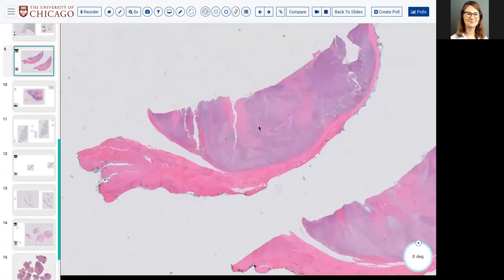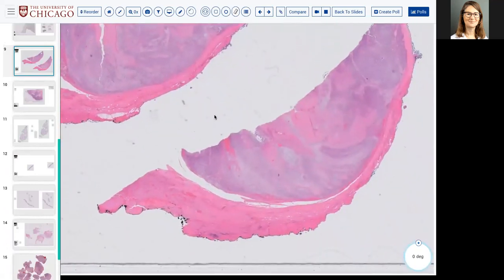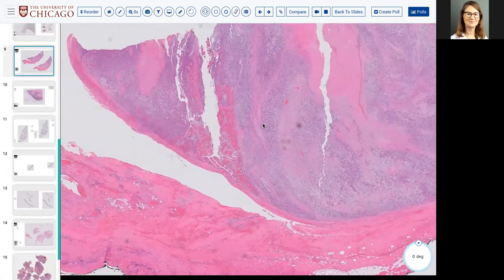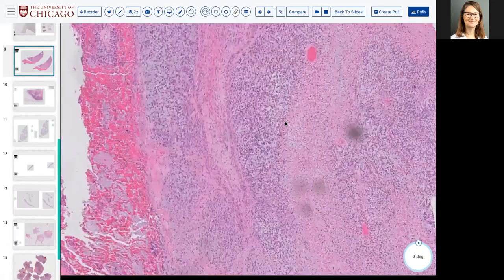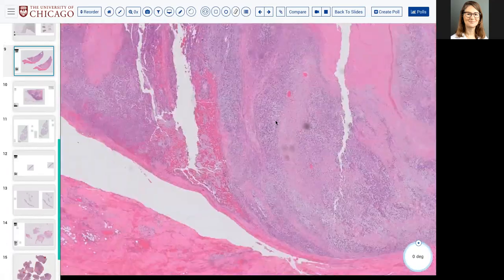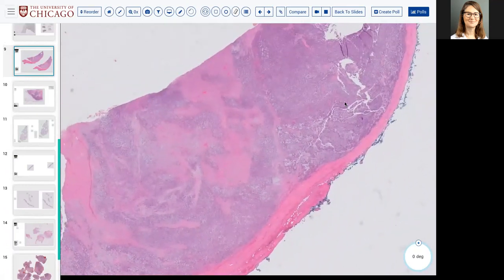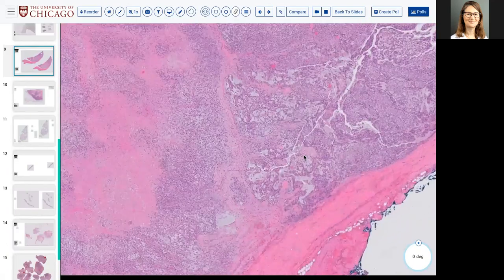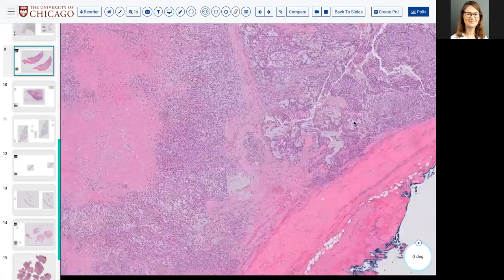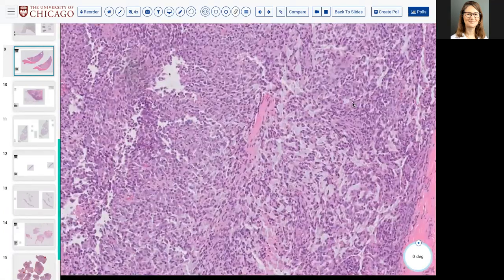All right, if there are no other questions, I'll start moving on to the next slide. And with each case now, we start to progress and see something a little bit different. It's really these subtle morphologic differences that can push you into one pattern of thought or another, right?